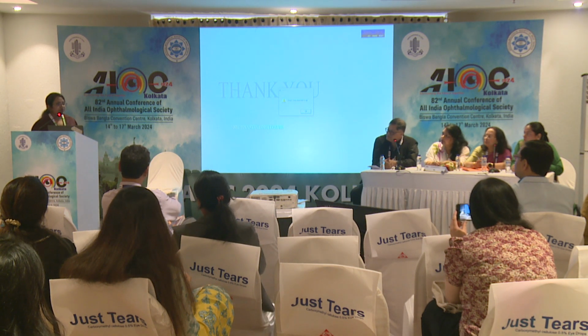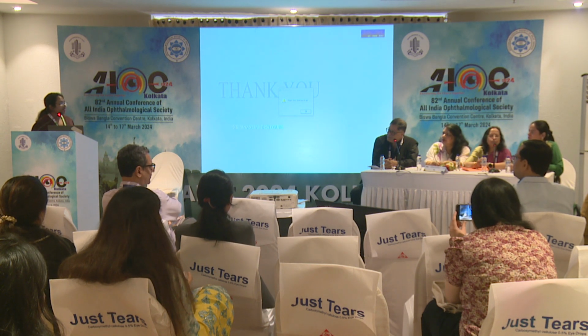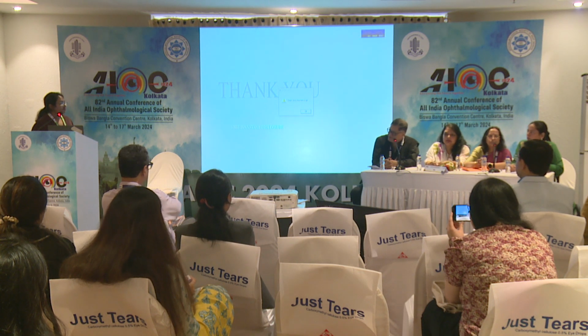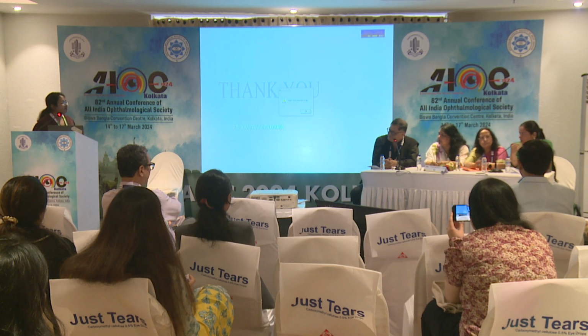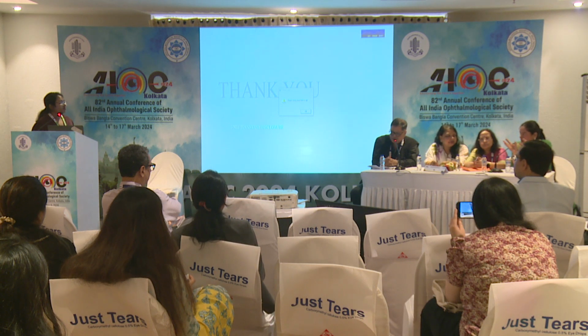Sir, in our setup, we have a peristaltic AMO compact phaco machine. Yeah, that's a good phaco machine. It's not easy to divide a soft cataract. The video which you showed, that it fractured with the two dialers, but when it's a very early soft cataract in NS1, it's not easy to fracture it. I have only one video. Please collect all your cataract cases, because if it comes out so nicely, it doesn't actually happen. This was not a soft cataract. The video shown has 2+.